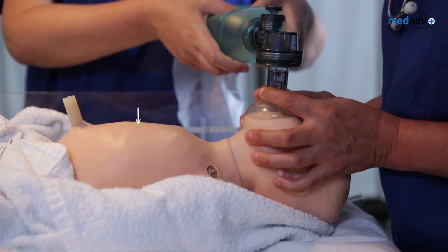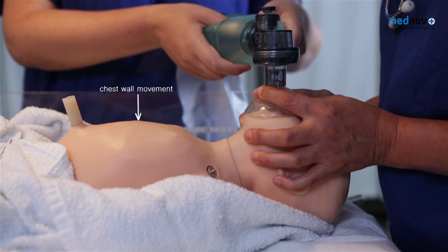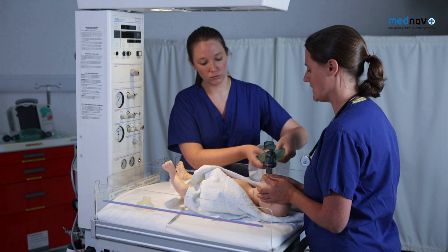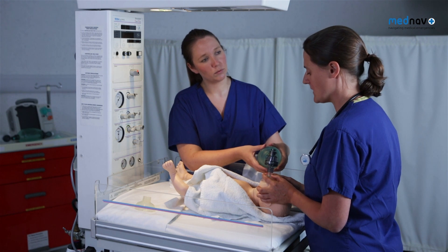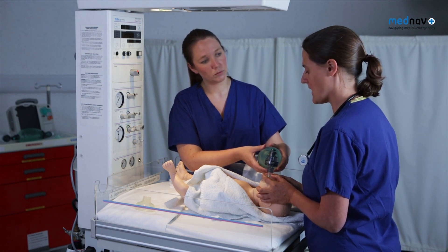Deliver 5 inflation breaths using the two-person technique, counting 1-2-3 for each breath. If the chest wall is not moving, then you need to consider advanced airway techniques such as a Gudel airway.